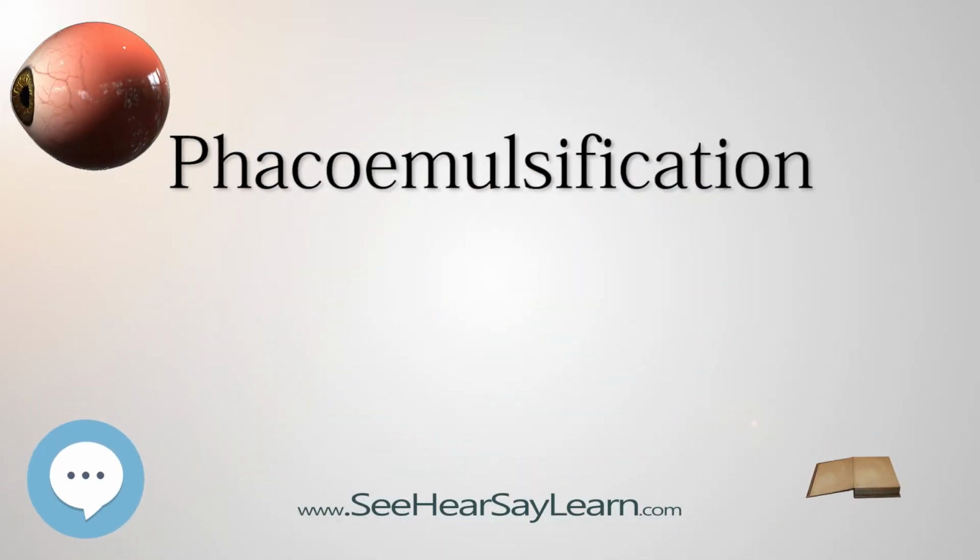Phacoemulsification is a modern cataract surgery in which the eye's internal lens is emulsified with an ultrasonic handpiece and aspirated from the eye. Aspirated fluids are replaced with irrigation of balanced salt solution to maintain the anterior chamber. Etymology. The term originated from phaco, Greek phako, comb form of phakos, lentil, sea lens, plus emulsification.